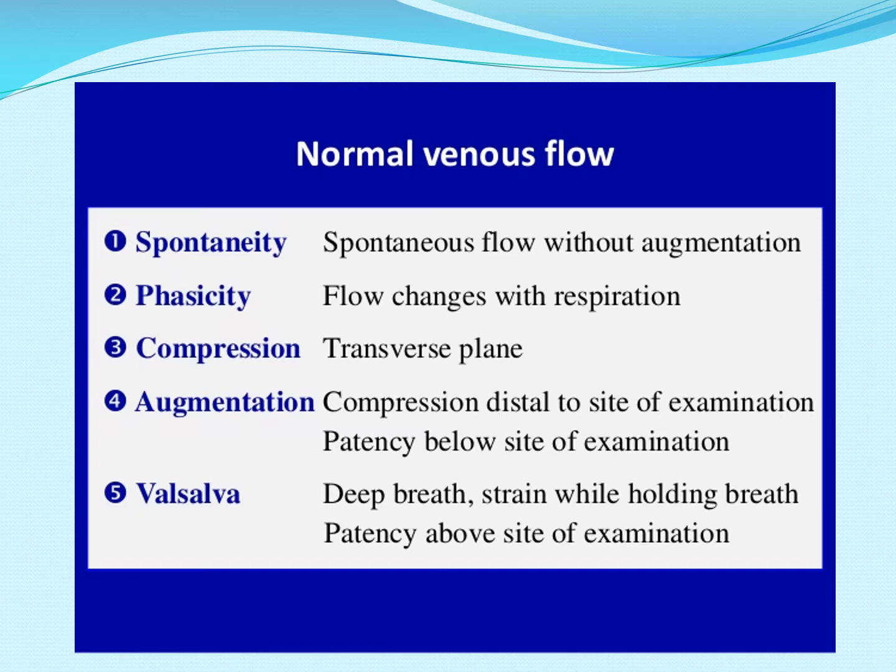These are some tips on how to distinguish the normal venous flow compared to that of the arterial flow. For example, if your patient has a large structure such as the IJ up in the neck, you're going to have your patient take a deep breath, strain while holding their breath, and this will provide a Valsalva technique. This will provide great compressibility to distinguish between arterial flow versus venous flow. Compressibility is another option, and there are several more as you see on this slide.